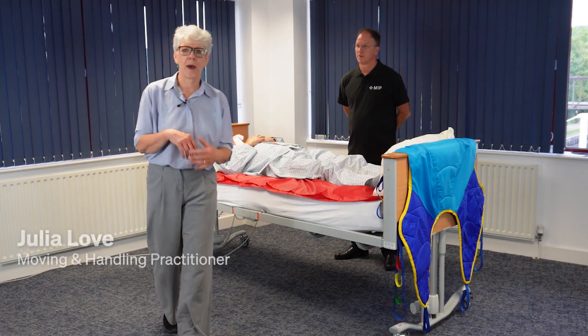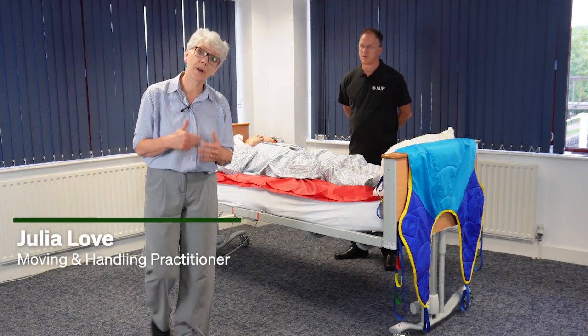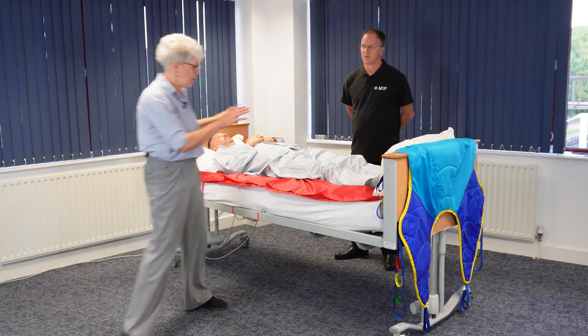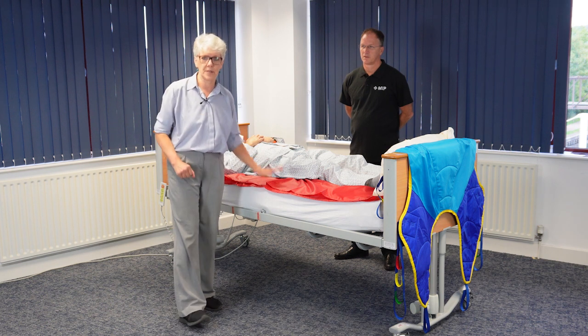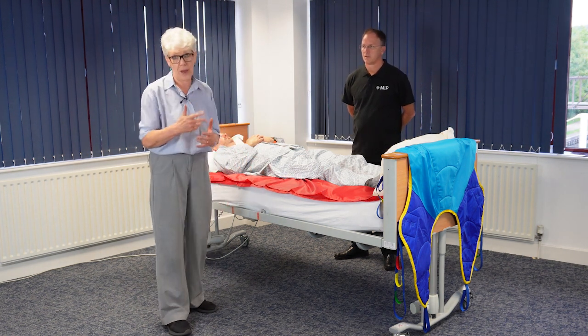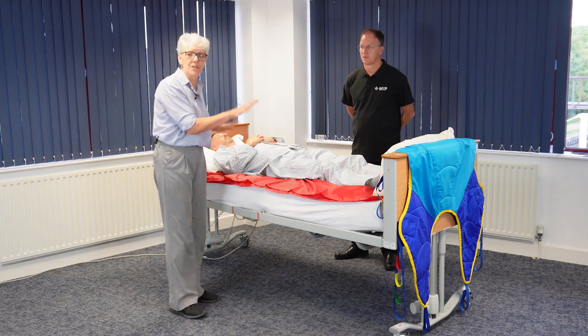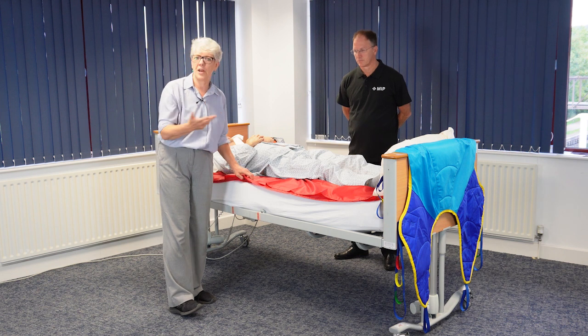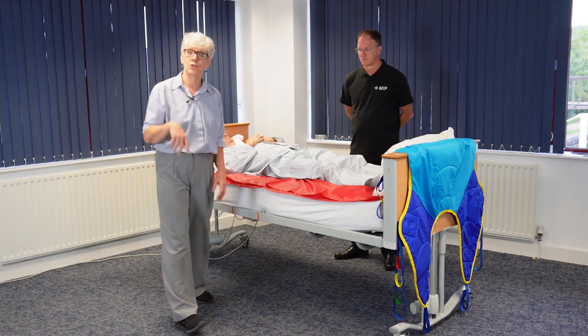Hello, my name is Julia Love. I'm an independent moving and handling practitioner and I'm going to show you how to position a sling using a full-length tubular slide sheet. We're using this technique to minimize the amount of rolling for the patient. We've already positioned the slide sheet, and if you want to know how to do that, there are videos on the MIP UK YouTube channel.